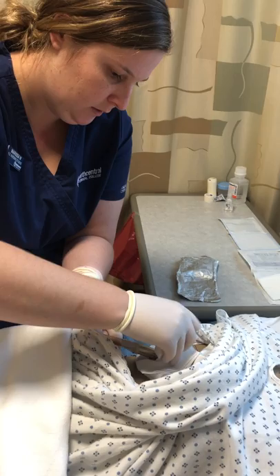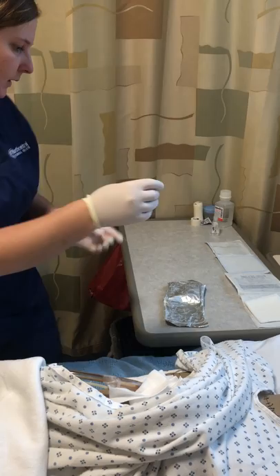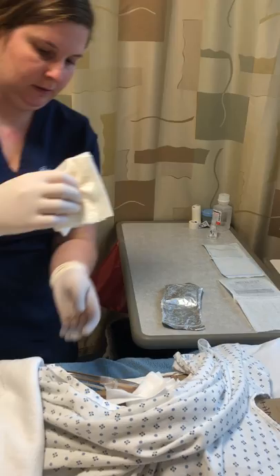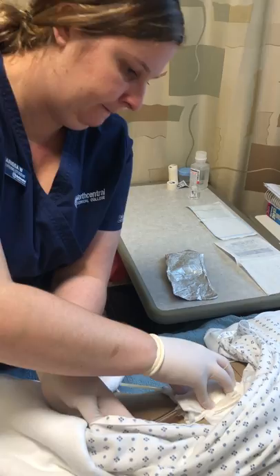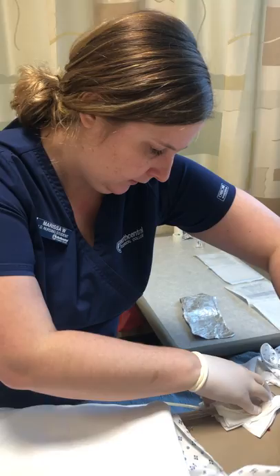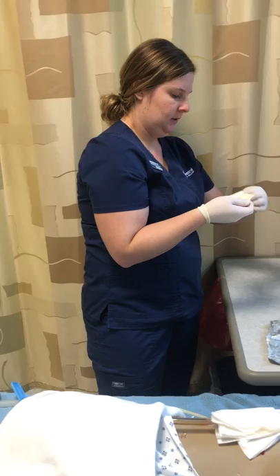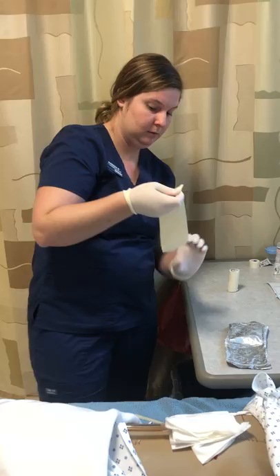One way, and another way. And then I'm going to grab my sterile gauze and put that in place. This is my clean hand again. All right. And then my hands won't be considered sterile anymore, but I'm going to grab my tape. When I'm grabbing my tape, I'm going to keep it as sterile as possible. I'm not going to touch the middle of my tape, just the edges here.